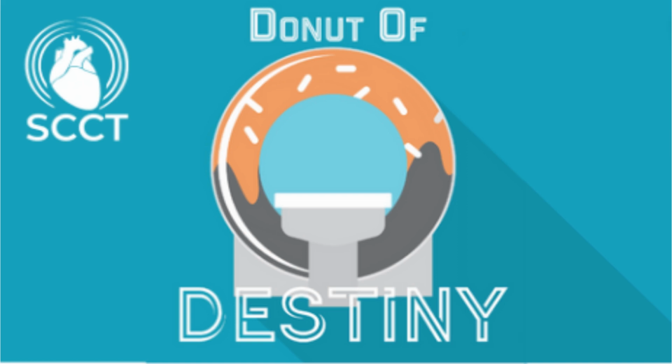HALT is thought to represent subclinical bioprosthetic leaflet thrombosis. That thrombosis word raises the alarm for clinicians. We think about valvular dysfunction, progressive heart failure, increased stroke risk, embolic complications, and the requirement for anticoagulation, as well as the risks associated with anticoagulation. Unlike clinical device thrombosis, HALT is subclinical and, by definition, occurs without symptoms. However, it's still that thrombosis word and its association with bad stuff that makes us scared.